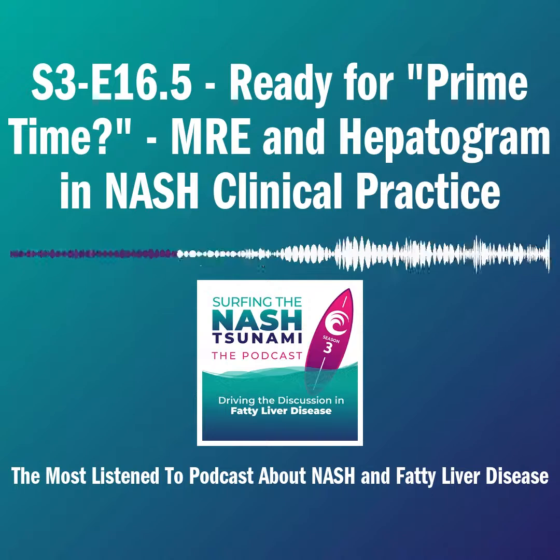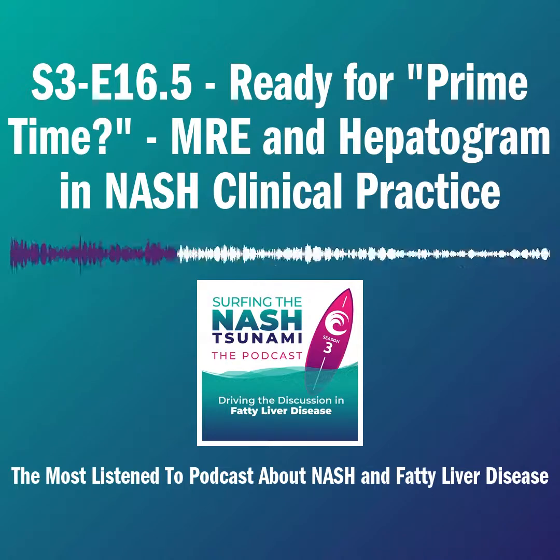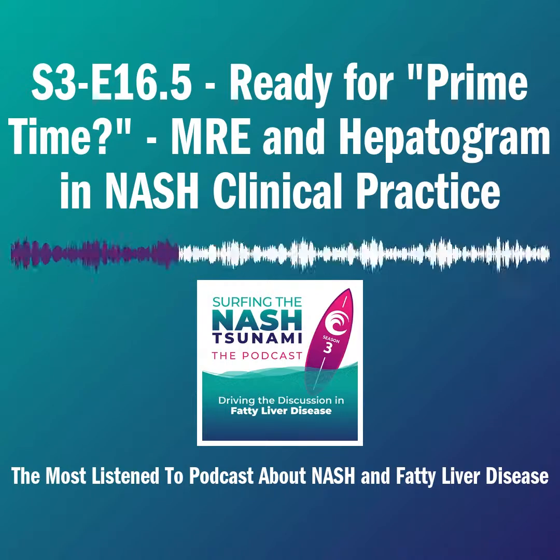It just takes a couple of breath holds. It depends on the specific technique. The original techniques were about 4 breath holds. You can do it in about 1 breath hold right now. So it's actually quite fast. The longest it takes is just the setup time, which is just a couple of minutes to get it secured quickly. So the whole thing can be done in less than 5 minutes.